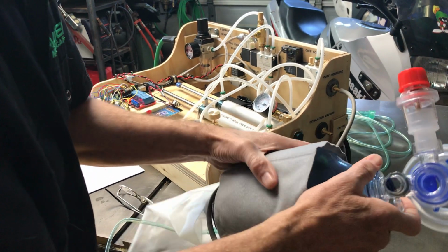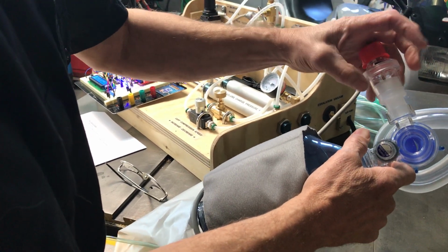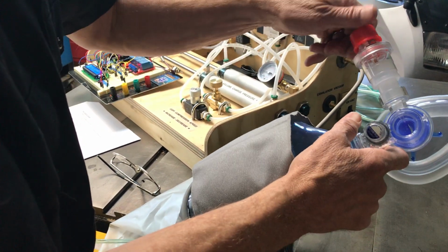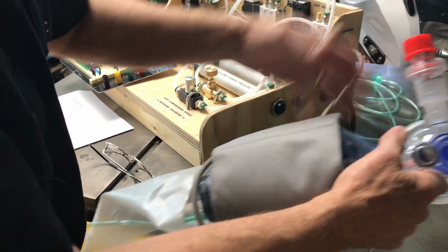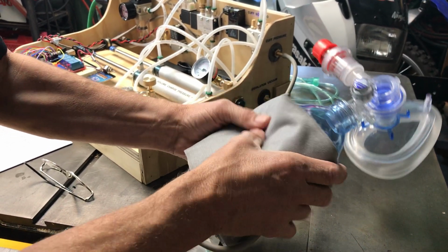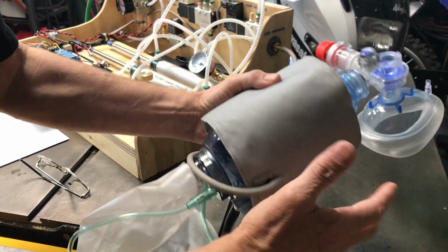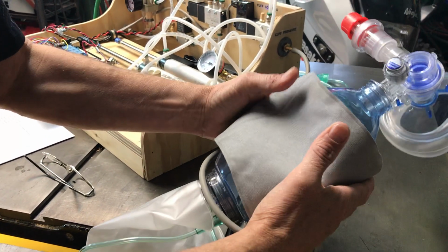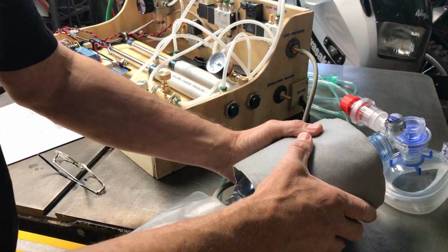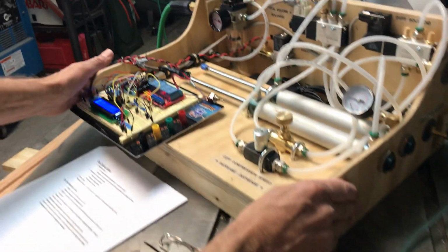The beauty about these is that one of the important things about ventilating a COVID patient is PEEP, which is basically a back pressure that maintains pressure on the patient above ambient even after exhalation, and that is to keep the lungs open. These are adjustable, and there's no sense in reinventing the wheel. They all come with the bag valve mask. Proven design, proven to be functional for ventilating in the medical system, currently being used, and that's what we're tapping into for our ventilator. We wrap a very common blood pressure cuff around the bag, and that's what provides our mechanical force for ventilation. This is controlled by the Arduino and the industrial side very carefully to provide measured ventilation to the patient.